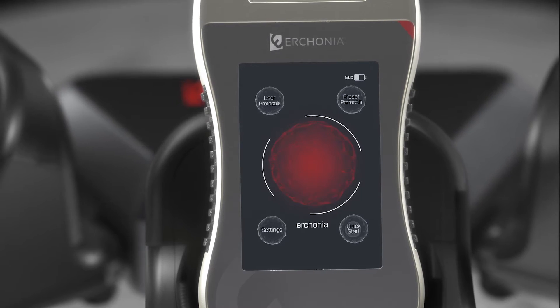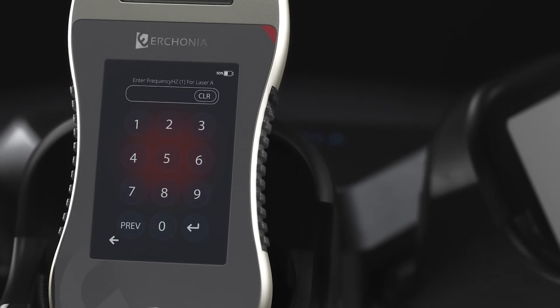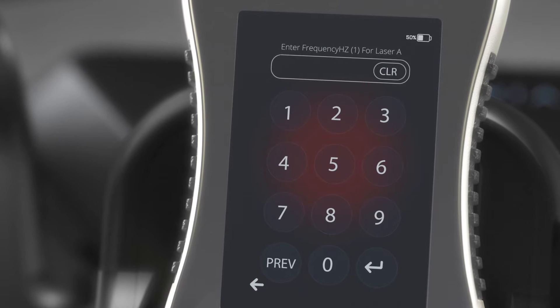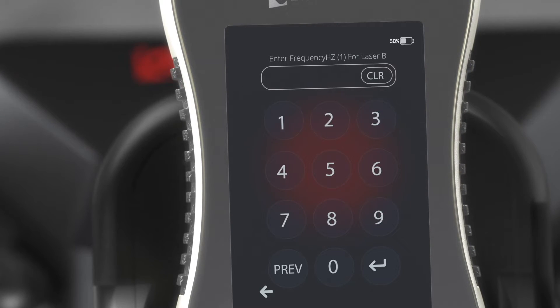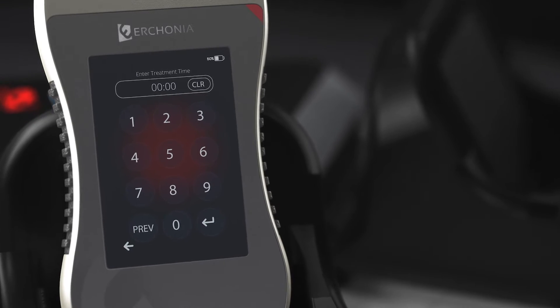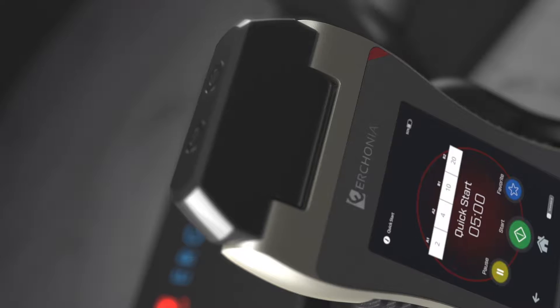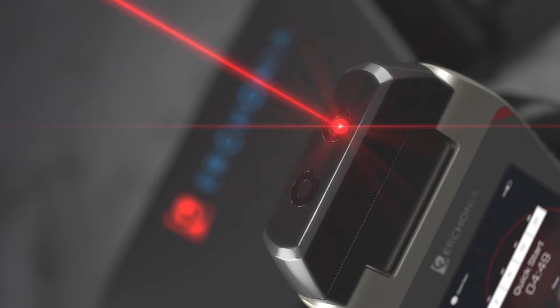Quick Start is for manually running one-off protocols that will not be saved into the device. An Urconia laser protocol consists of four frequency numbers, two per laser diode. The first screen asks for frequency 1 for laser A — let's input 2. Then frequency 2 for laser A — let's input 4. Then frequency 1 for laser B — let's do 10. Then frequency 2 for laser B — let's do 20. Next it asks for treatment time length — let's do five minutes. Hit Start and you'll see laser A blink two times per second for two seconds, then four times per second for two seconds, and laser B blink ten times per second.